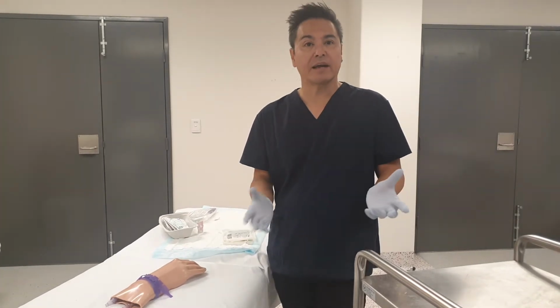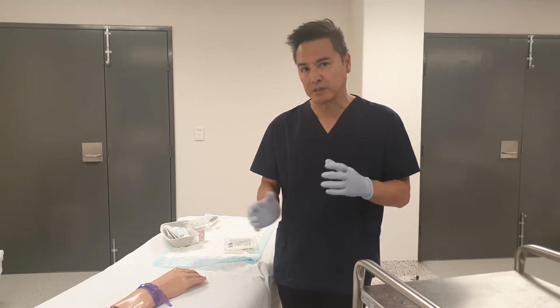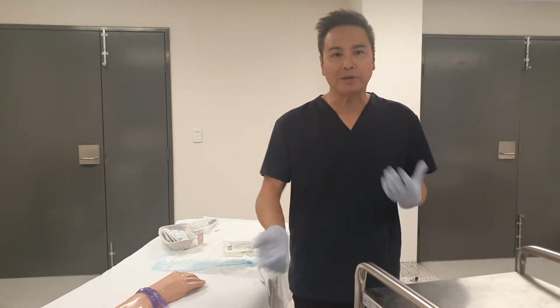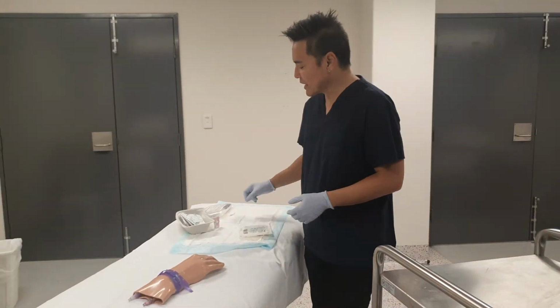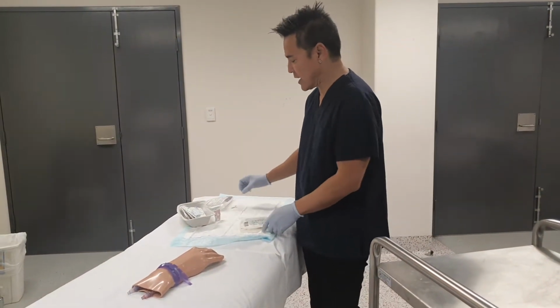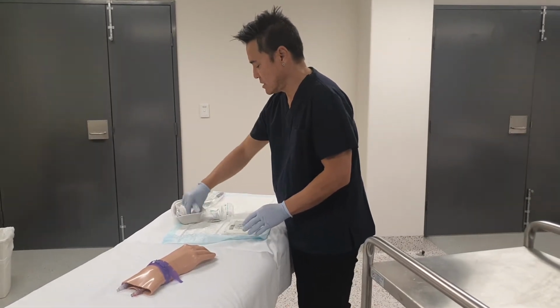And at the end of the day, this is a revision video. You've done IV cannulation. I know that you've got your own little systems in place, and I want you to work out what's best for you. I'm just showing you the way I do it. Okay, so once I've actually established that, I will get my flush ready early.